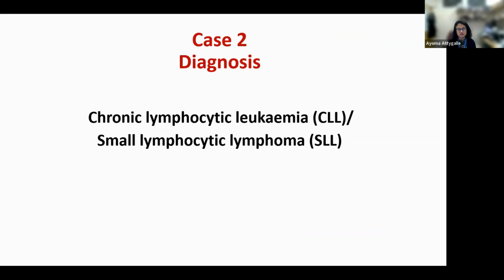So the diagnosis in case 2 is CLL-SLL, and the reason why these cases are biopsied is often an incidental finding of a lymphadenopathy when they are assessing the patient for something else, and sometimes the clinician has not even bothered to do a full blood count. Because if there is a raised full blood count, with lymphocytosis, and the lymphocytosis is due to the CLL, then there's actually no need to do the lymph node biopsy.